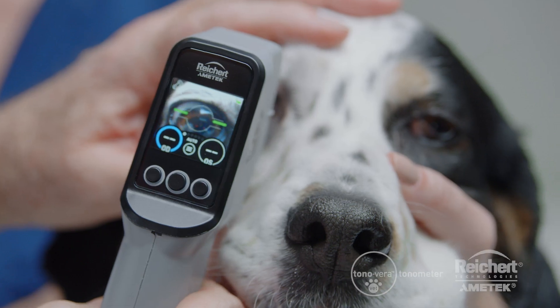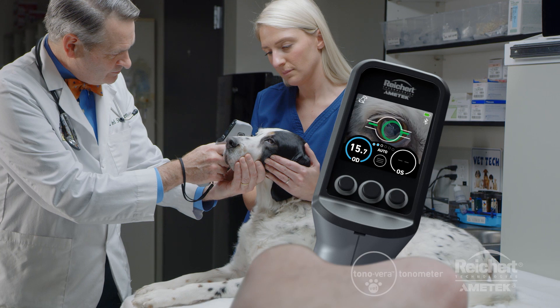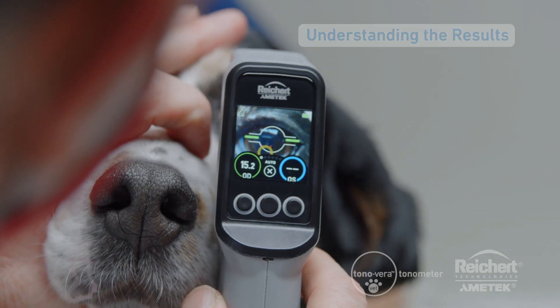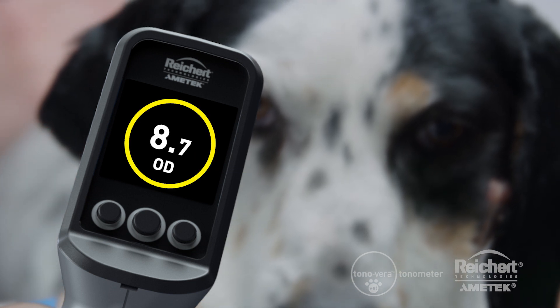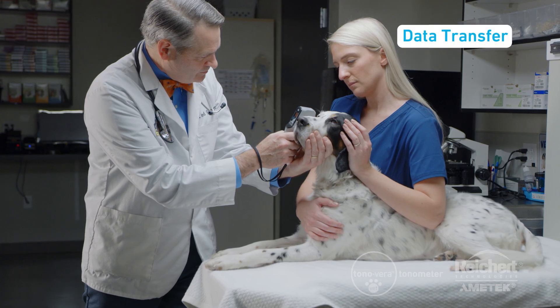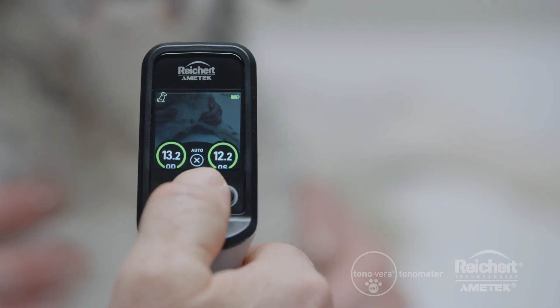When properly positioned, the Tanavera Vet takes an IOP measurement automatically. The measurement dots will fill in as each measurement is taken. Reliable IOP results can be obtained in a single measurement, which reduces stress on pets. The color of the ring indicates the reliability of the measurement: a green ring means you have a high confidence result, a yellow ring means you have a low confidence result, and an orange ring with an arrow inside it indicates that you should retake the measurement. The Tanavera Vet is equipped with Bluetooth so you can quickly and easily send IOP results to your electronic medical records. You can clear out measurements for a single eye or clear out all the measurements at any time.